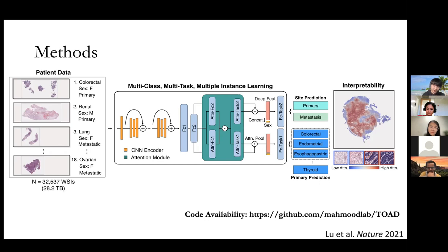And because my training set doesn't cover the whole distribution, in all of the cases where the rare morphology appears, I also have the first, more common morphology. In which case, all I have to do is assign high attention to the first, more common morphology, and I can just zero out the other morphology, right? I can assign a zero attention score to that, and I should still be able to, at least in training, do very well.